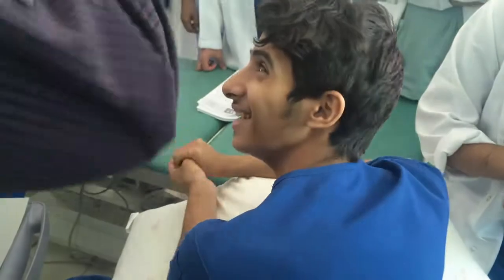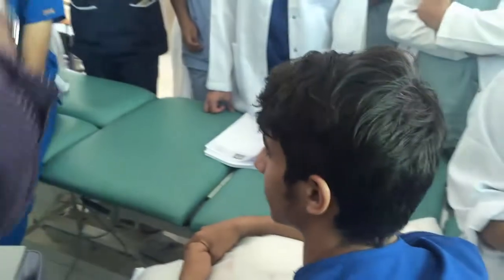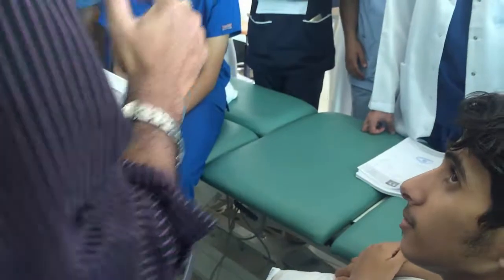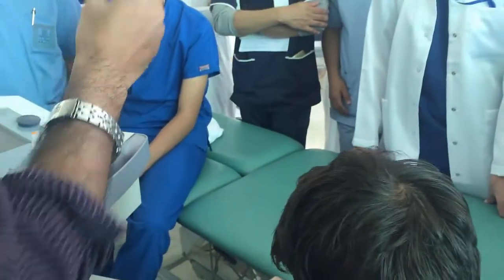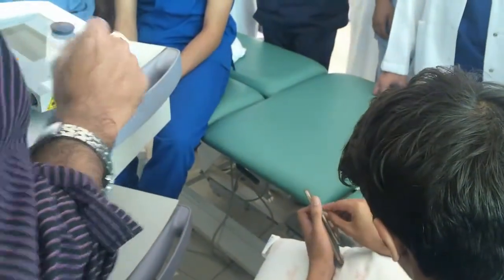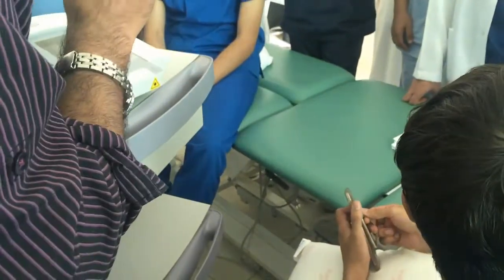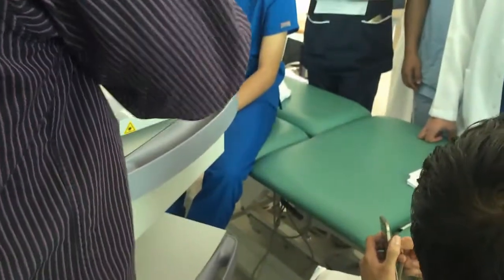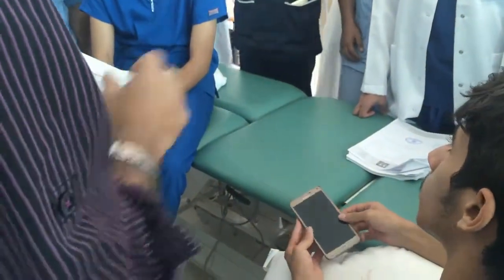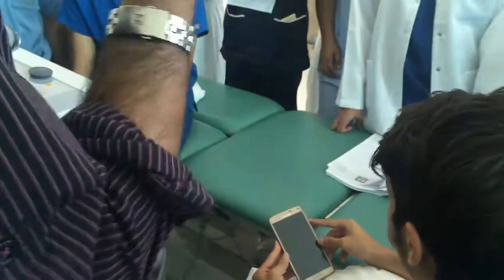So, those things you should do in practicals. Operating the machine, if you operate it wrong also, no problem. If you do all these things correctly, I can give marks. Understood? Operating the machine is the last step. I am not saying you should not know, but you should know this also. But before this, you should do all these things. Then only, because treating is last. Understood what I am talking? Before giving treatment, you should do all those things. Understood what technique you are going to select. Okay, what is the problem?